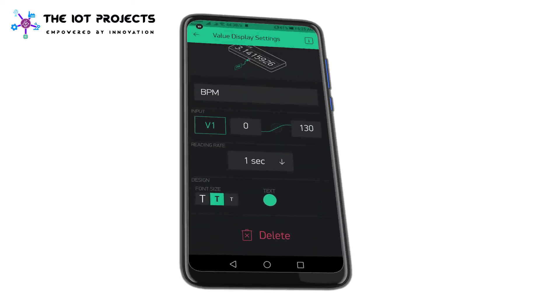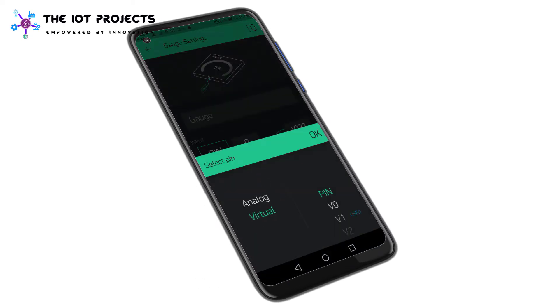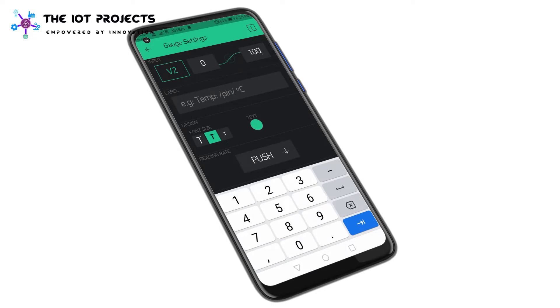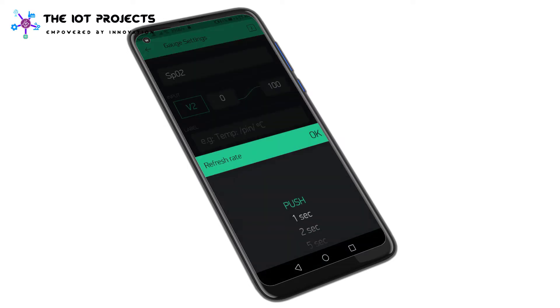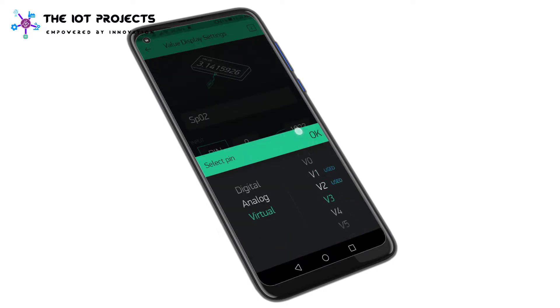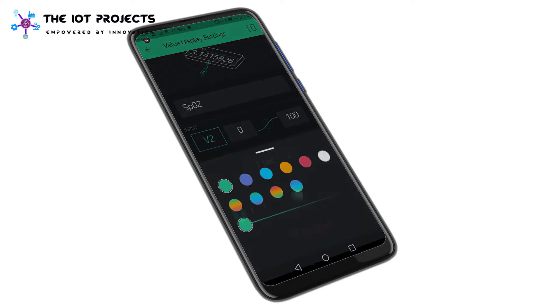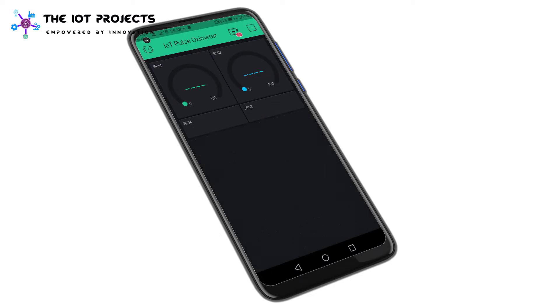Now we will configure the oxygen level widgets. Select virtual pin V2 and set the values from 0 to 100, with one second as the refresh rate. Apply the same settings for the value display widget — select virtual pin V2 and values from 0 to 100, with one second as the refresh rate. The application setup for the IoT-based pulse oximeter is ready.